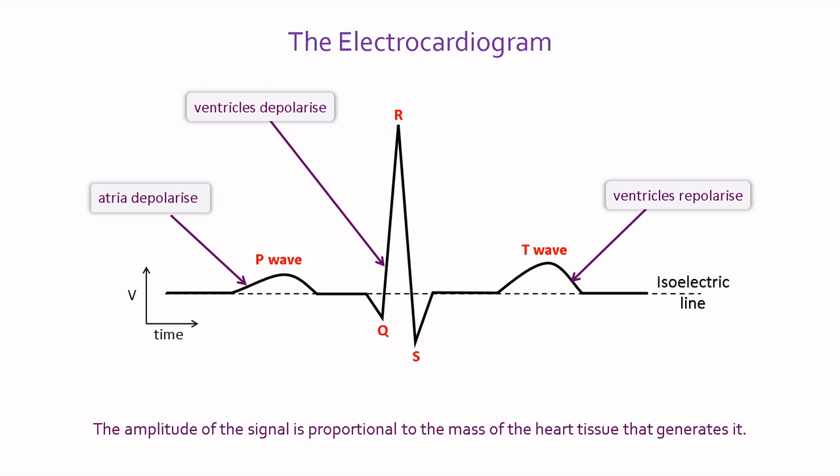When the ventricular action potentials reach the repolarization phase, the voltage between the positive and negative electrodes on the skin changes again, giving rise to the T wave. This is a useful feature of the ECG because the period between the QRS complex and the T wave gives a measure of the action potential duration.